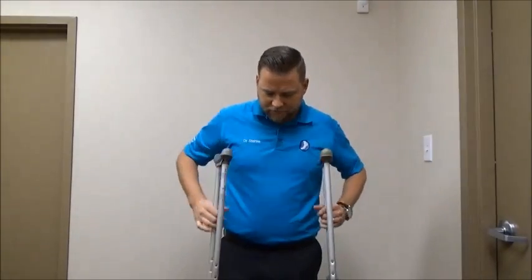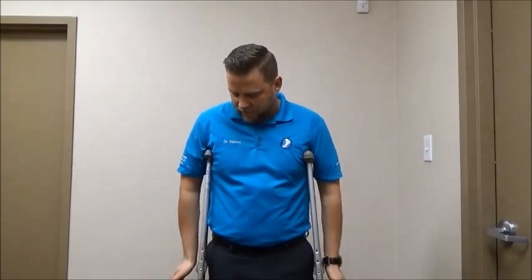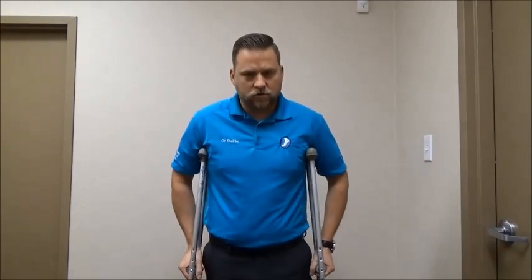After you set those, you want to look at the height of the crutches. When standing up straight, the crutches should not be encroaching into your armpits — they should be about two finger-widths below. The area where you hold your hands should be about the level of your wrist, so that when you hold the crutches standing up, you have a slight bend in your elbows.